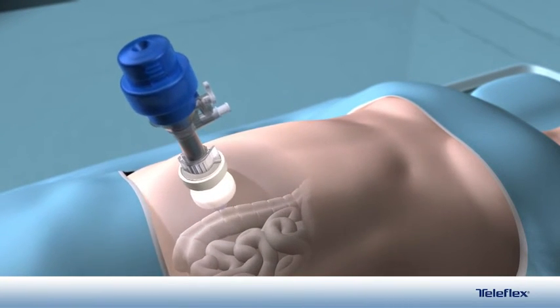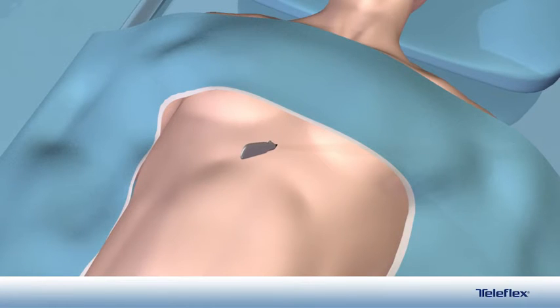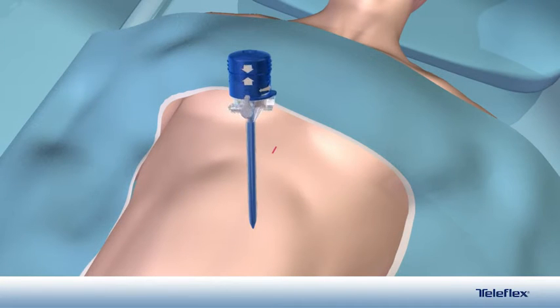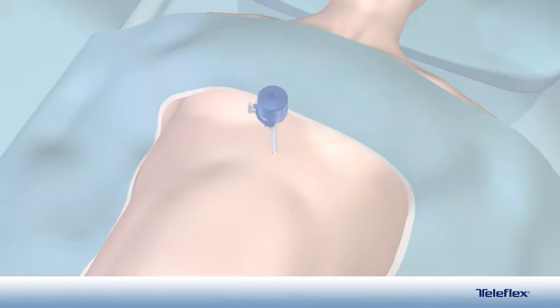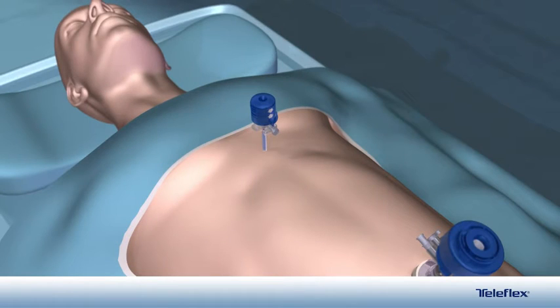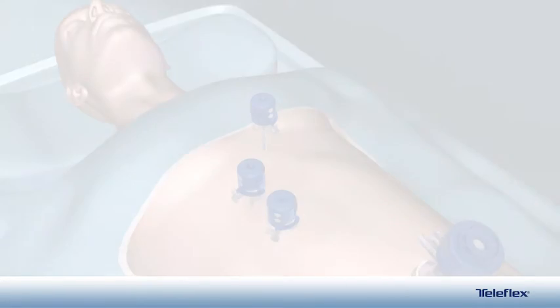The abdomen is insufflated. A small skin incision is made inferior to the xiphoid process. A 5 mm access port is inserted through the incision using an exaggerated 9 to 3 rotation while applying steady downward pressure. Next, two additional 5 mm ports are inserted, one in the right upper quadrant and another inferior to the previous port.